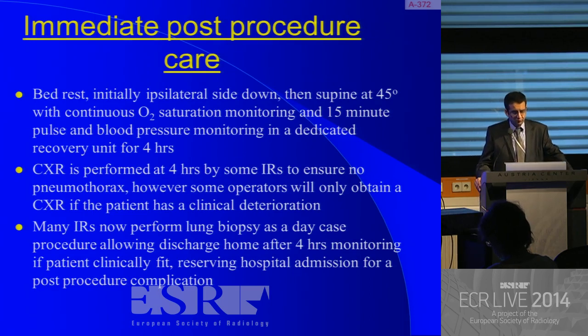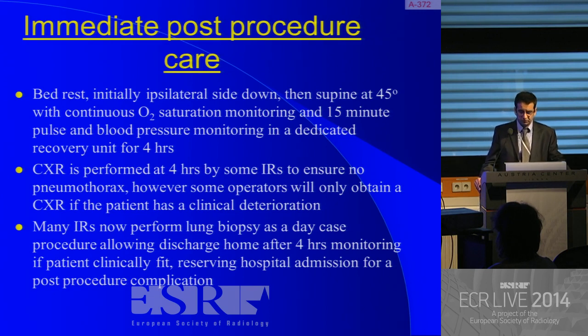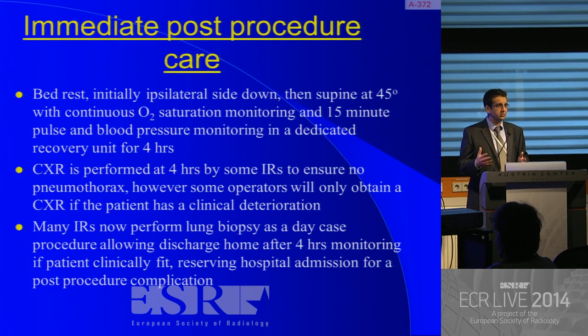Post-biopsy, it's important to have bed rest. Initially, it's advisable to have the patient on the ipsilateral side down. This will help reduce further hemorrhage or the pneumothorax enlarging. Then you can place the patient supine at 45 degrees. Continuous oxygen saturation monitoring. It's important to monitor the pulse and blood pressures. And I think, more importantly, the patient should be in a dedicated recovery unit where they are being monitored.